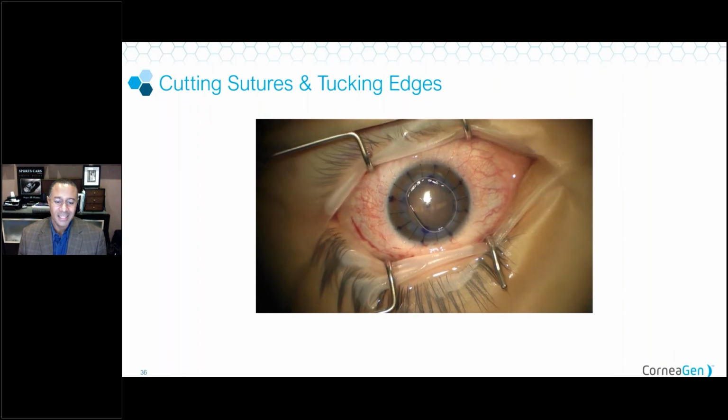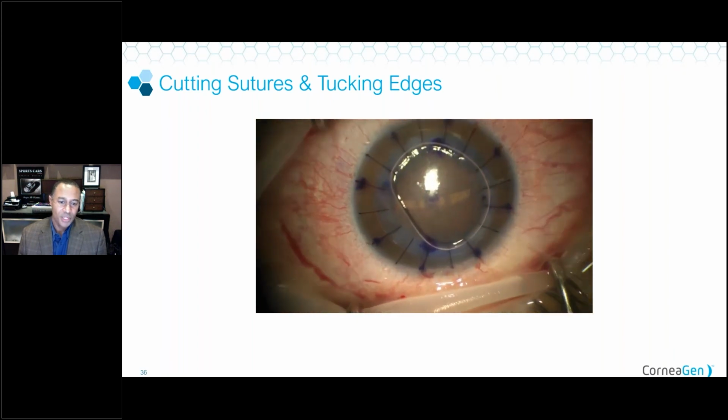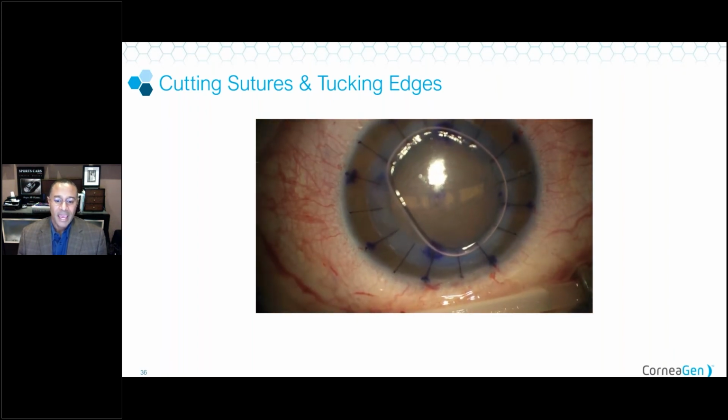The contact lens helps the patient with comfort, particularly with those knots being up, and makes them feel very comfortable and encourages epithelial healing of the surface. So this basically concludes the surgery where we'd be here. I don't normally put in subconj injections of antibiotics or steroids. We just use our regular postoperative drops, and patient goes off to the recovery room with patch and shield. Next slide.